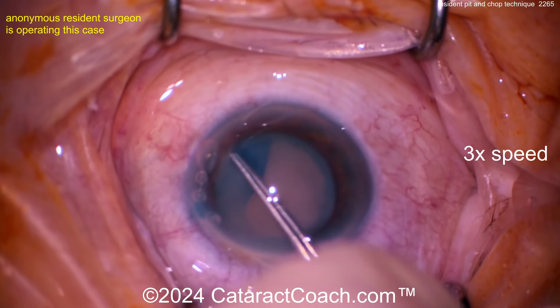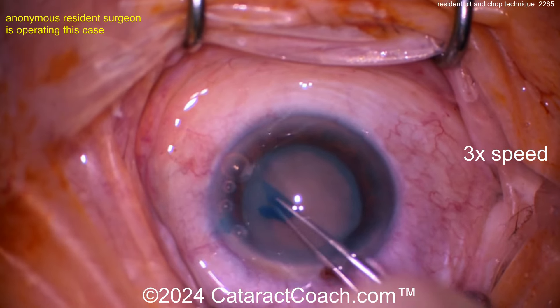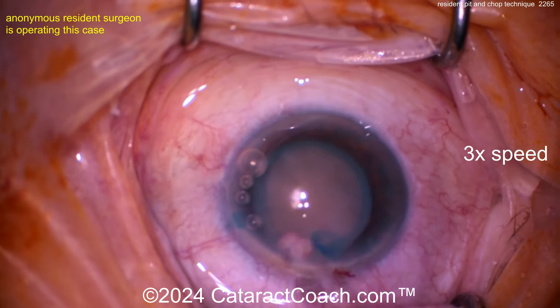Nice generous rhexis, I like that. This is not a baby rhexis. As you know, cataract coach says no baby rhexis — you don't want a baby rhexis, especially with a dense nucleus like this. This has got some pretty good density to it.